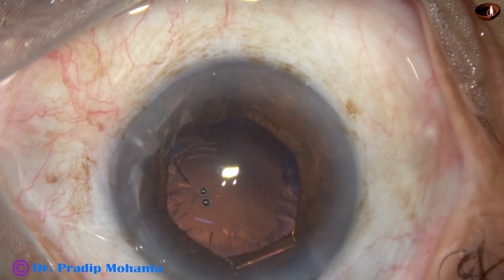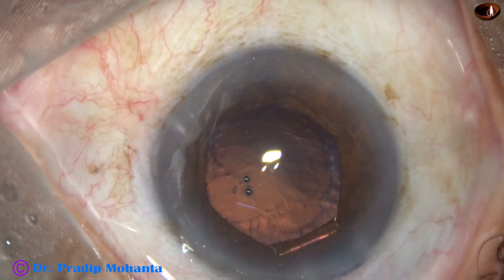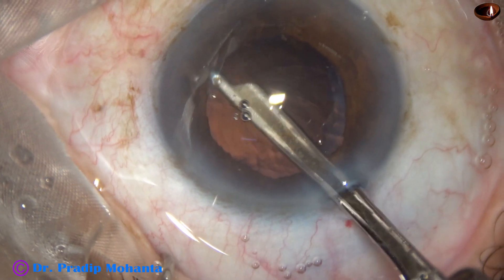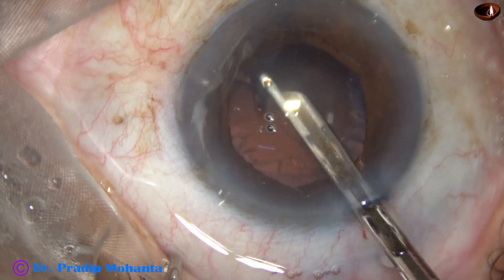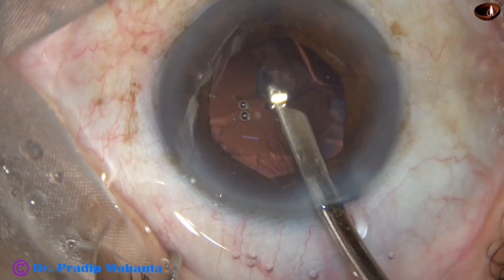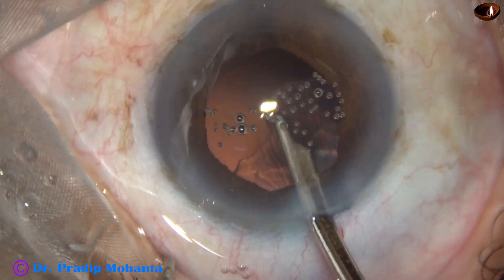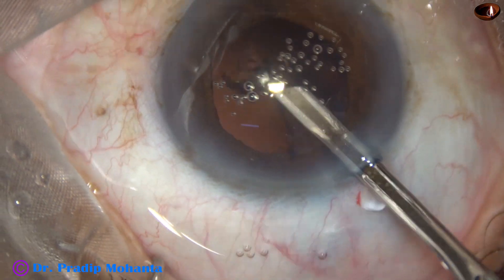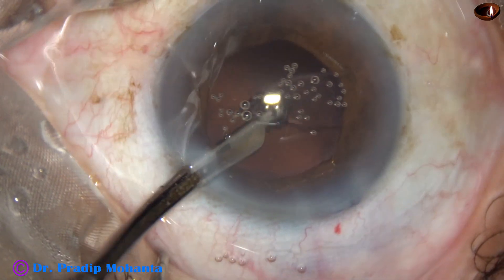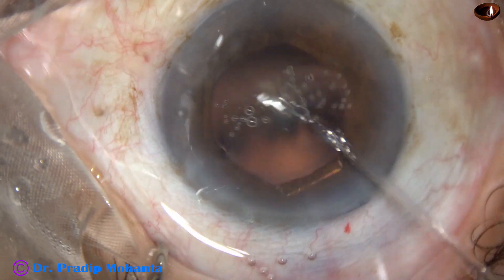From the beginning and during emulsification of the last piece, the vacuum is reduced to 250 and flow rate to 25. So the nucleus is managed. The nucleus has come out. Now a thin sheet of cortical matter remains and it has to be removed. I am using a Simcoe cannula — a 23-gauge Simcoe cannula. We can use a 22-gauge Simcoe cannula also. Most of the lens matter has come out. Now we go through the side port and remove the remaining cortex. Yes, the cortex has been removed nicely.